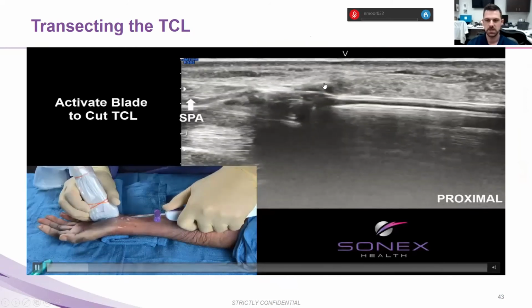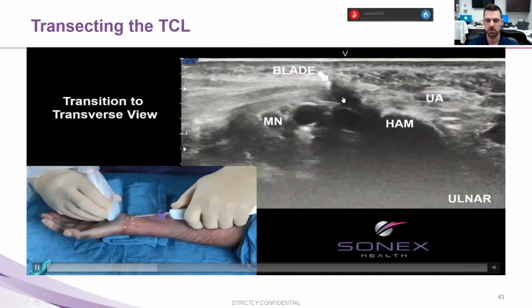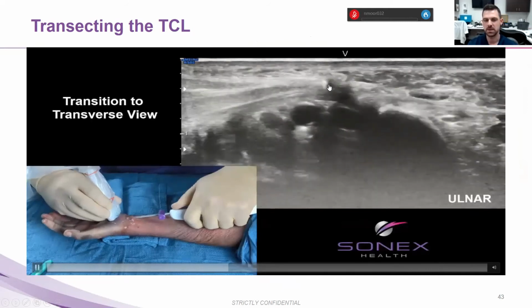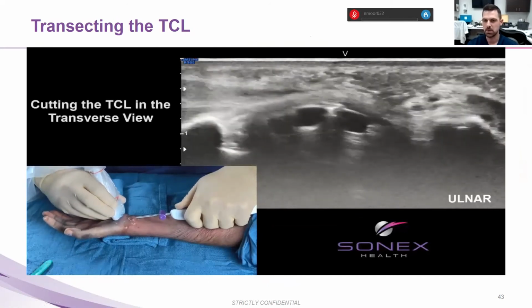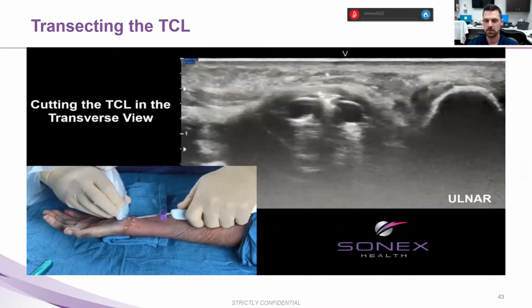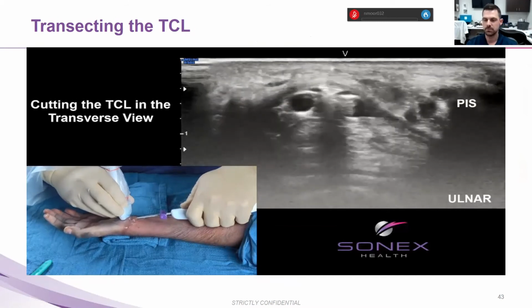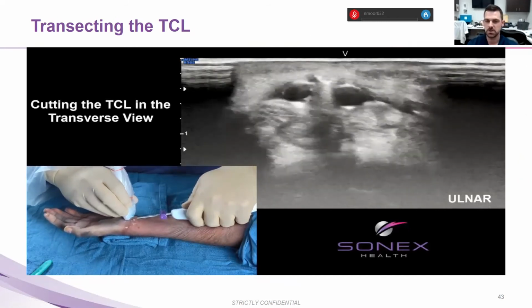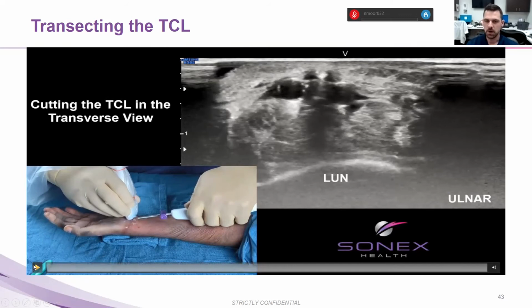So you can watch and see, here's the blade activating, okay, at the distal taper. And then you turn the probe so that you're short axis to the structure again, and there's the blade tip. And then you slide the probe slightly proximal, engage the blade into the plane of the probe, so that now you're seeing all the way along that you're not affecting either of the neurovascular structures ulnarly or radially. So, you can see why this is safe, right?